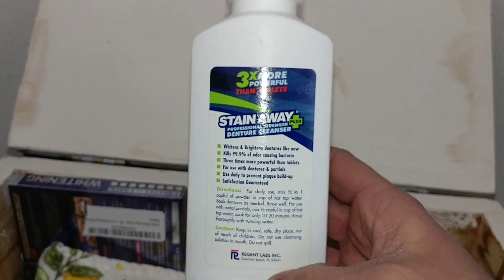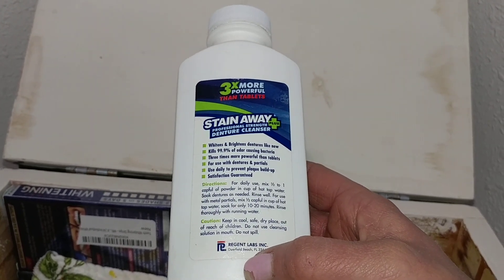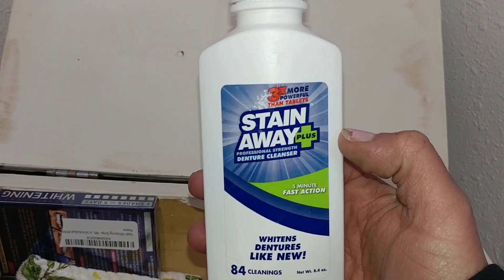I clean my denture every day with the Stain Away. Since I do have a partial, I can only use it for about 15 minutes — it's not okay for me to soak each night — but it keeps my dentures really clean and really bright, and I appreciate that.